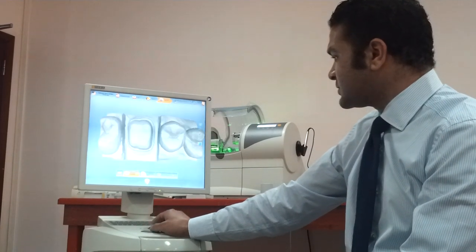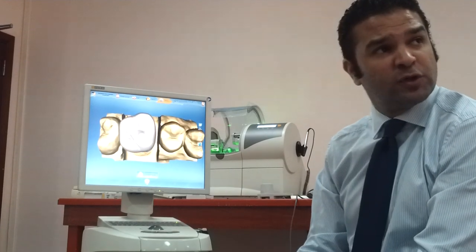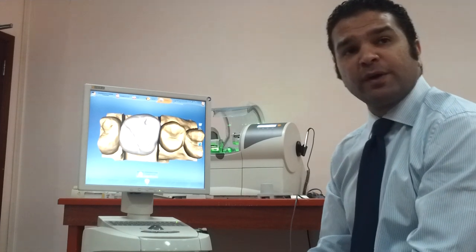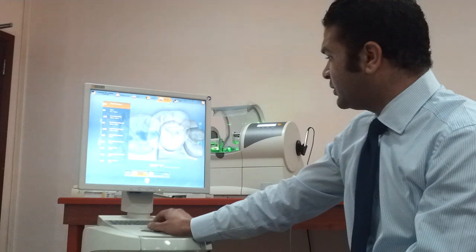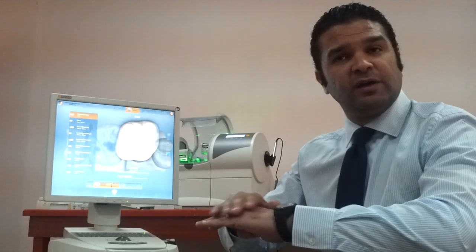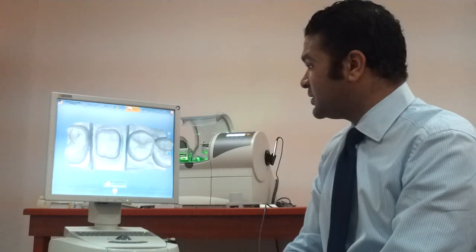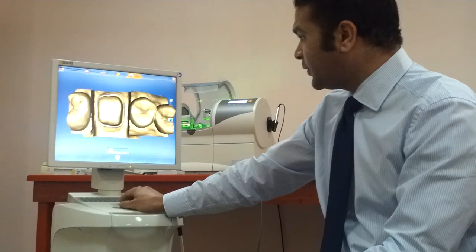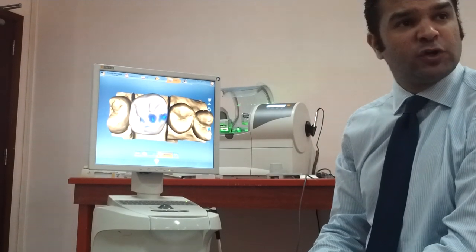I'll recalculate and the software gives me a proposal for my crown. I can play with the design — add material, increase or decrease contacts, and check occlusion. There's a library to check occlusal anatomy: for patients over 60 years, the software gives a flatter morphology reflecting attrition, while for younger patients you can choose juvenile morphology with more pronounced occlusal anatomy.